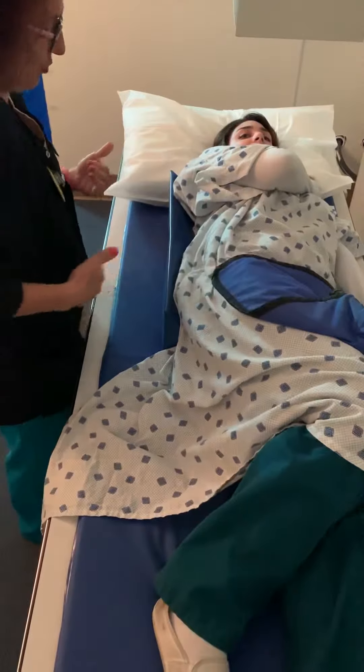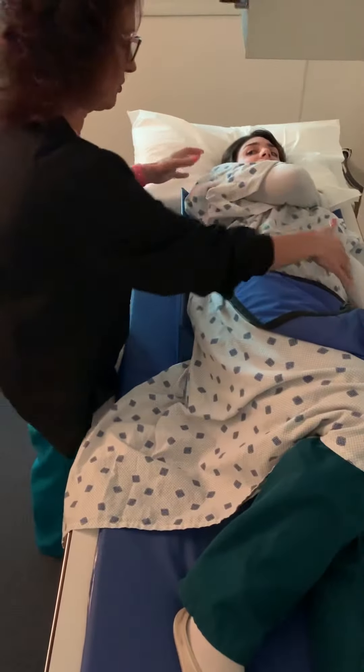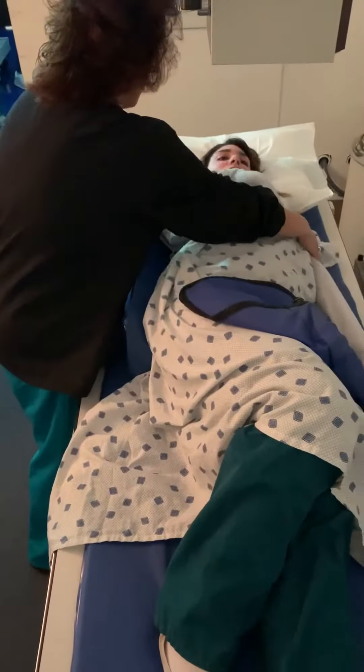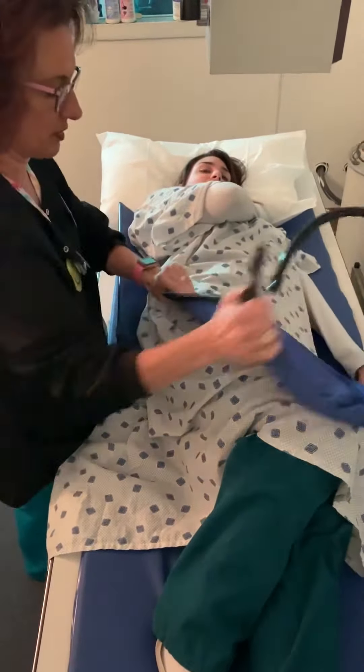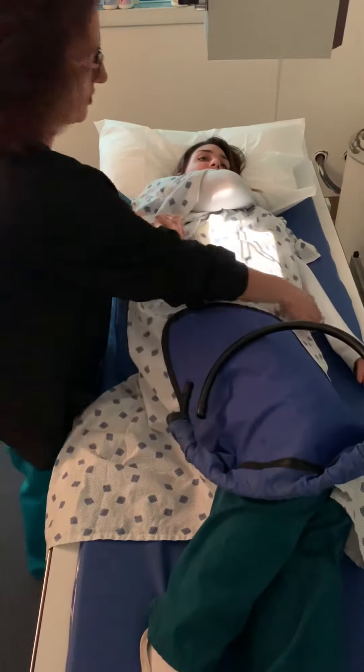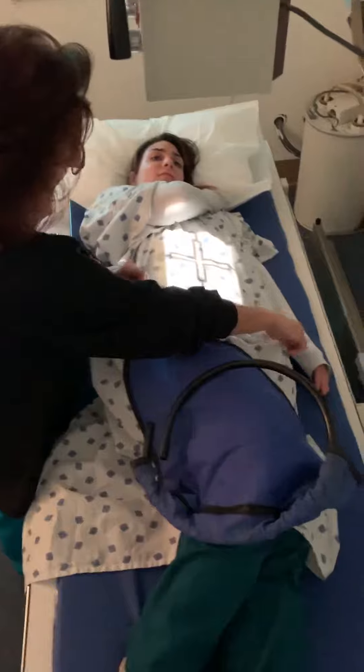Now what I should have done is actually brought her back towards me because she's going to be too far away. So scoot your hips back this way a little bit, scoot your hips back. Alright, stomach is still on the left, but now I'm collimated.